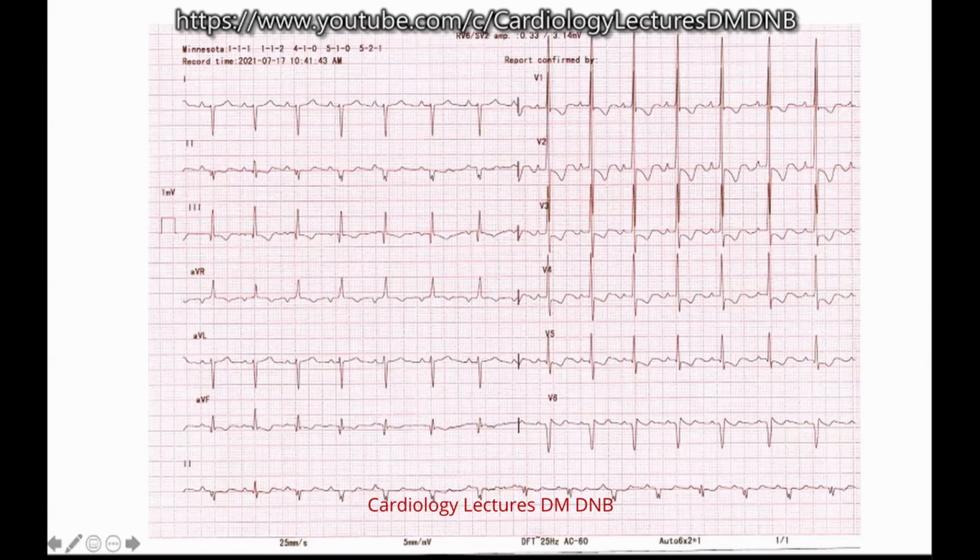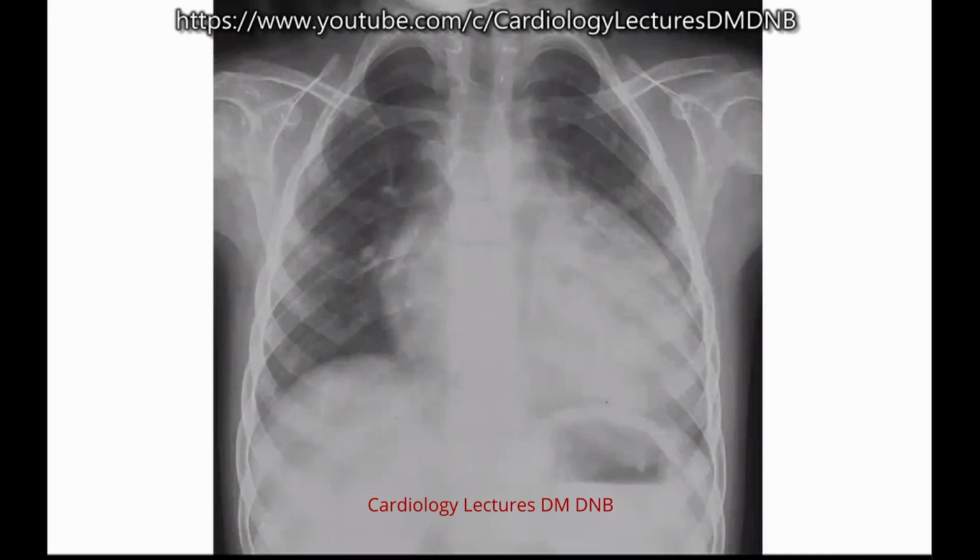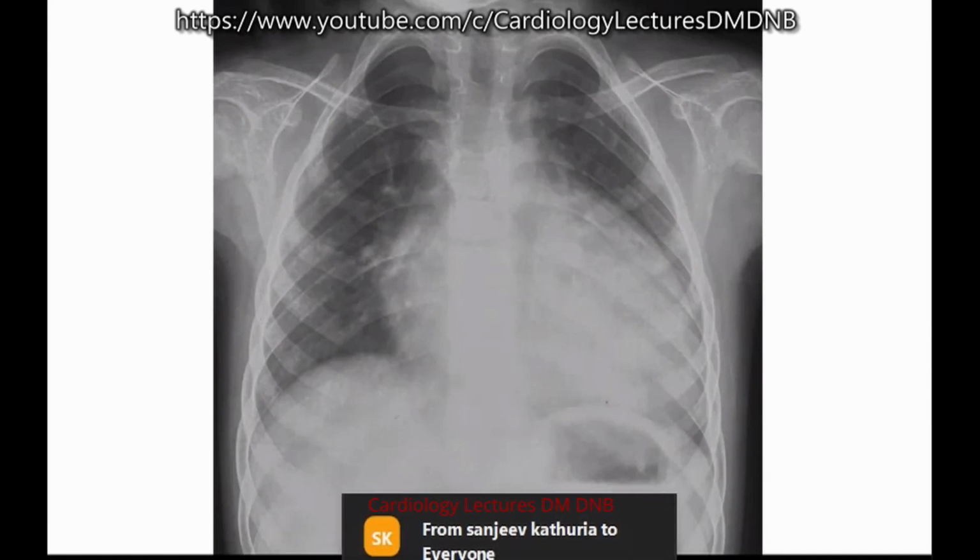Yes. So, shall we go for the X-ray? So this is the case X-ray. Can you describe the positive findings in the X-ray? Yes, sir. On the right heart border there is RA enlargement. So there is marked cardiomegaly. You start with cardiomegaly, not with the right atrium. First, you have to say how much cardiomegaly, if there is any. Yes, ma'am, there is huge cardiomegaly. The CT ratio is more than 0.55 for this age, and there is RA enlargement and the apex is of RV type.